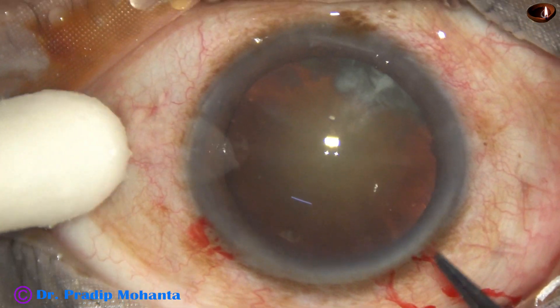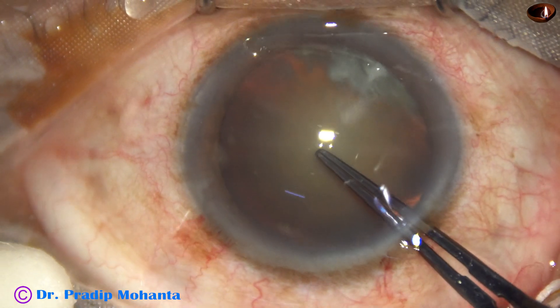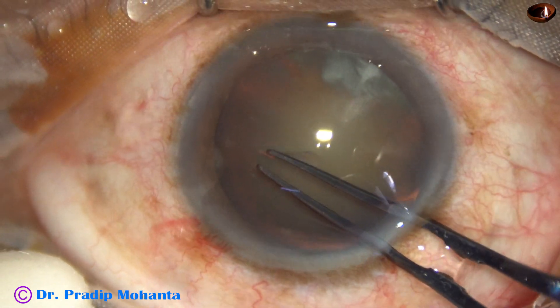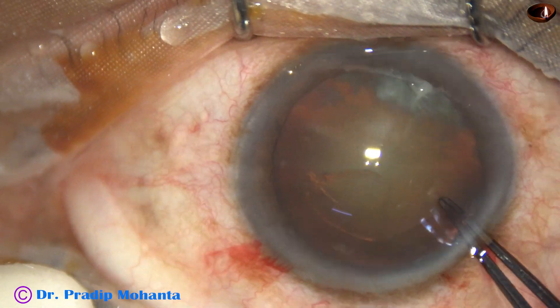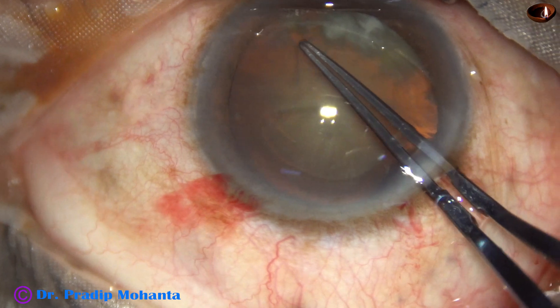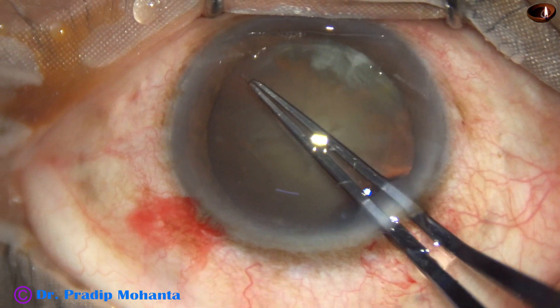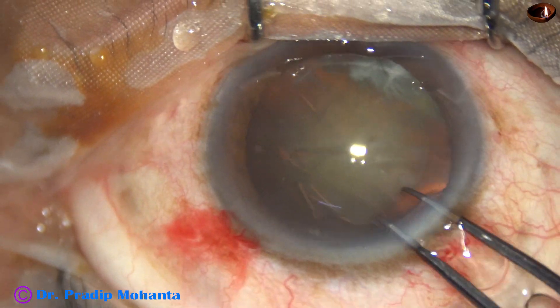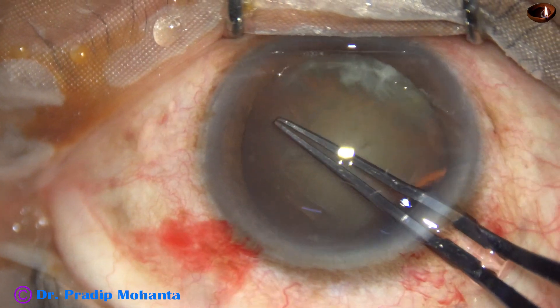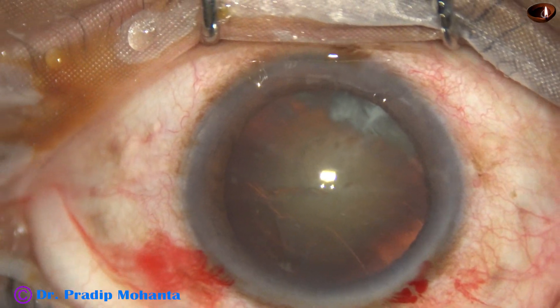And now we are going to do capsulorhexis. Capsulorhexis is being done with the help of utrata forceps. The tip of the utrata forceps pierces the anterior pole and a capsular tag is raised. This capsular tag is guided anti-clockwise to get an adequate size rhexis.